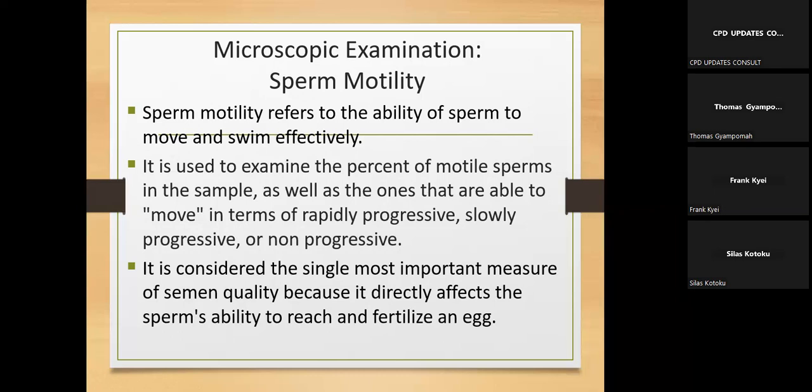But when you talk about motility, we have something called total motility. So motility in general. It doesn't matter whether somebody is moving fast or slow. Every movement is movement. So that totality is your total motility. I hope that point is clear.